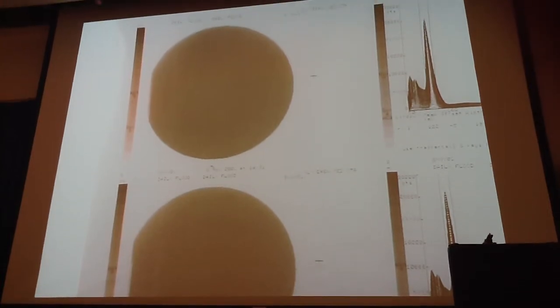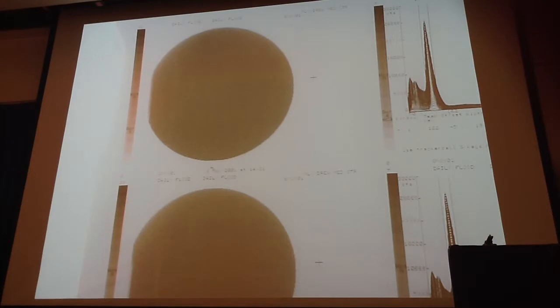If you have a round detector head, then if you calculate the circumference of that and divide that into 4,096, it still works out to about 10,000 counts per pixel. That's your 1% error at 95% confidence interval.